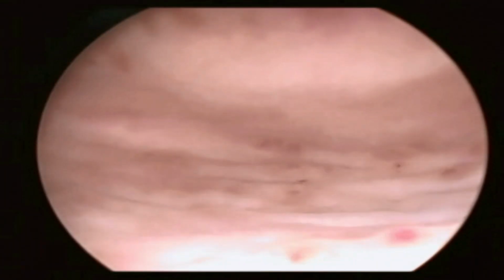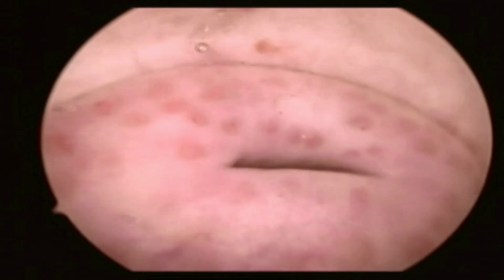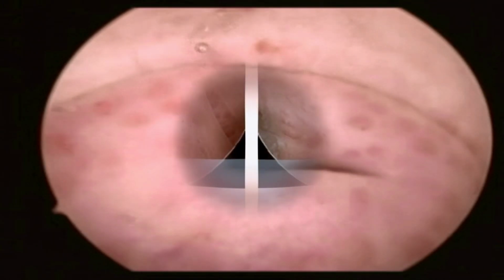Here, a simple vaginoscopy can give you a picture of infection. This is a chlamydial infection, which sometimes you miss if you do a direct hysteroscopy, in which you put a vulsellum, dilate the cervix and put your hysteroscope inside the uterine cavity. So two major points are missed in this. First of all, you do not do vaginal inspection, cervical inspection, and cervical canal inspection. That should be done in each and every case.